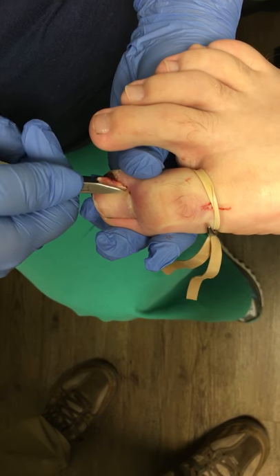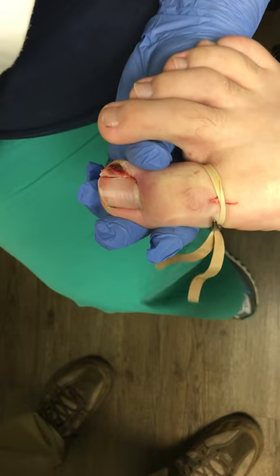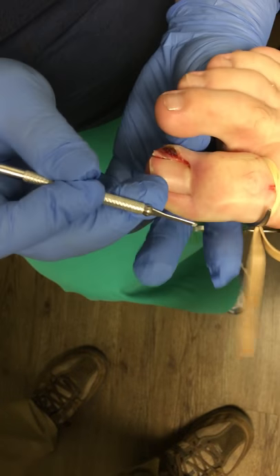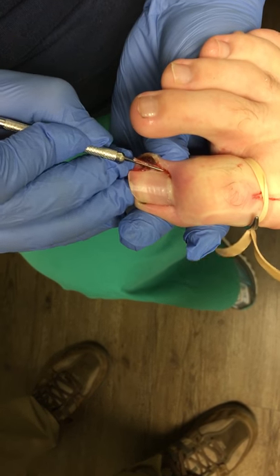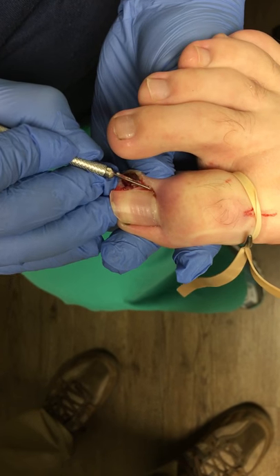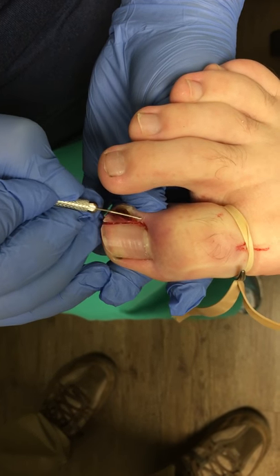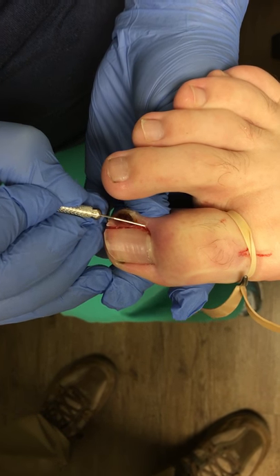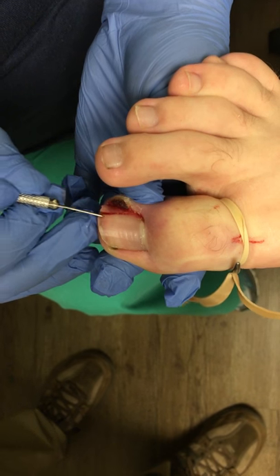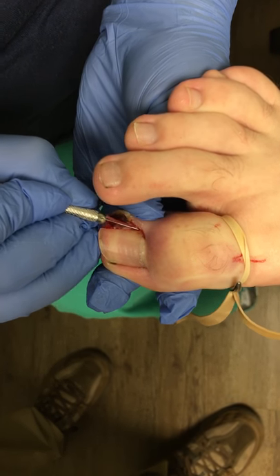You go down to about as far as you can reach — so there's our initial cut. Always check the beaver blade before you use it. The beaver blade follows that same line. Do you see how I turned my blade inward? If I go too straight, it's very common for patients to have a little residual nail right here that they'll feel during the healing process. So one of my techniques is to slightly angle it inward, and then that cleans up the last little bit of the cut.